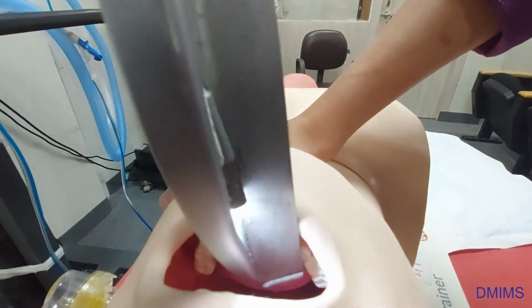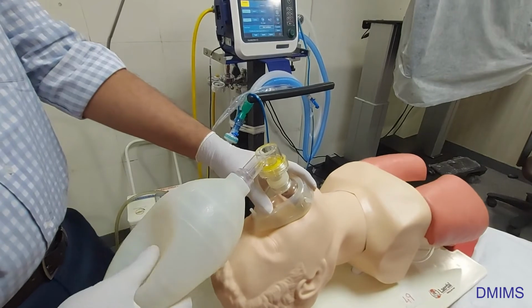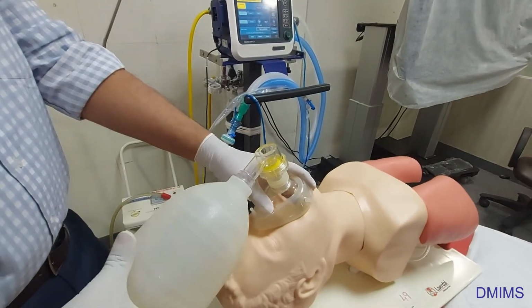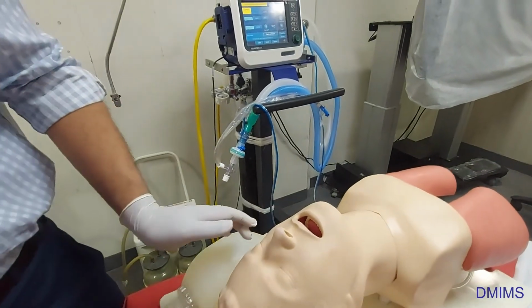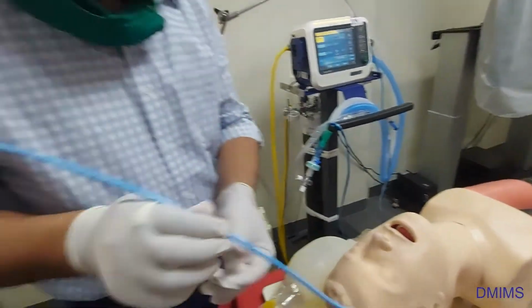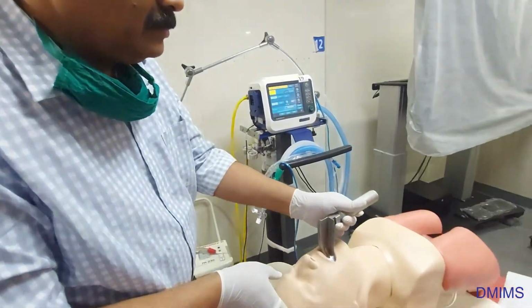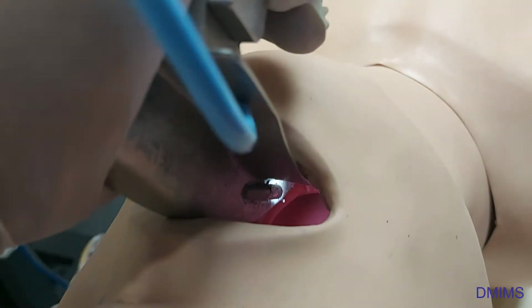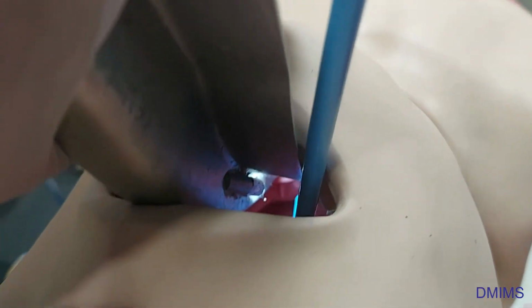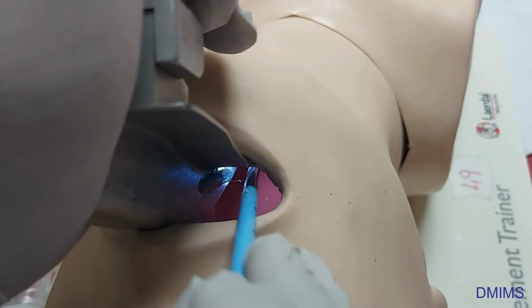So I will stop and come out, because I have to ventilate the patient and oxygenate. These are real difficulties during intubation. Intubation is not always simple. So I did the rescue oxygenation. Now I am taking the bougie. Now I am going in again. Now I can see the cords. I have entered into the trachea.